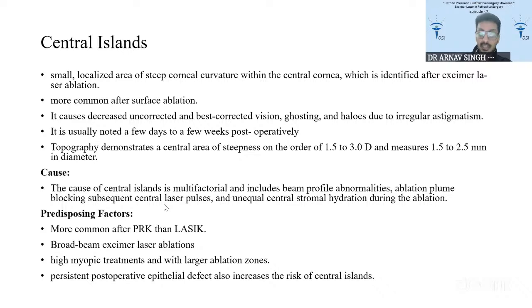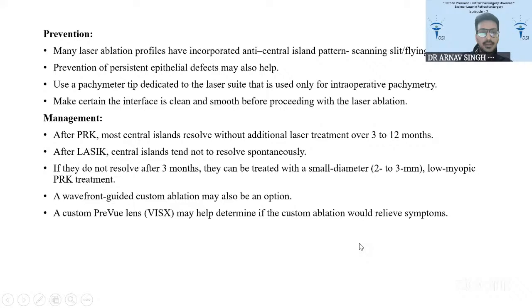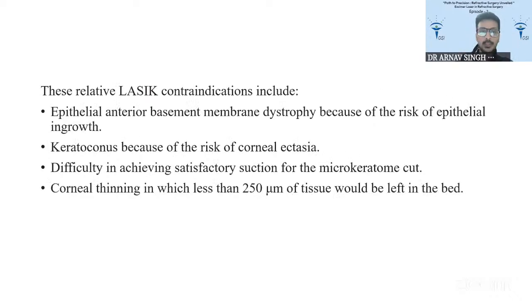It's more common in PRK compared to LASIK, and management includes: most central islands resolve without any additional lasers over a period of about 3 to 12 months. After LASIK, the central islands tend not to resolve spontaneously, and they do require an enhancement procedure.